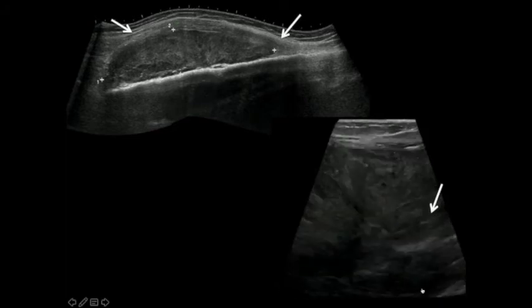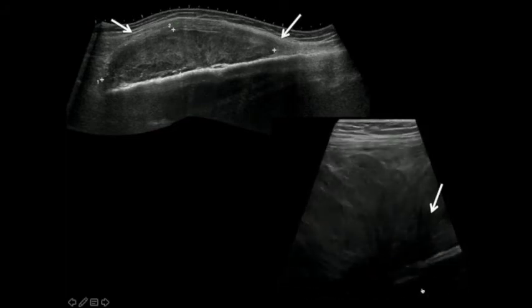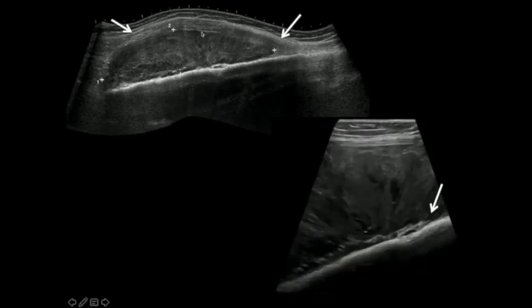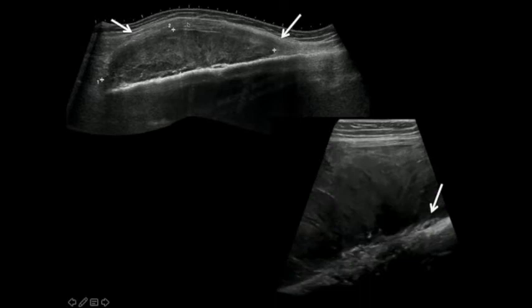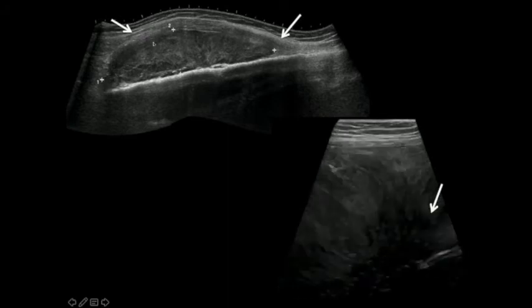This was another case. I had this young female who had this large mass in her thigh. She also had diffuse enlargement of her thyroid gland. And we did a biopsy of this mass under ultrasound. And notice here how you can see that the musculature is actually pushed very far anterior, so it's thin. And this mass is appearing somewhat separate.